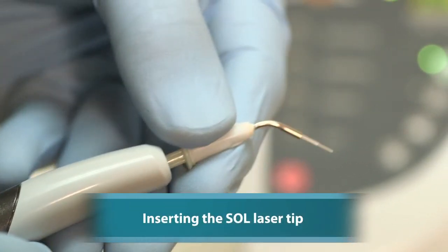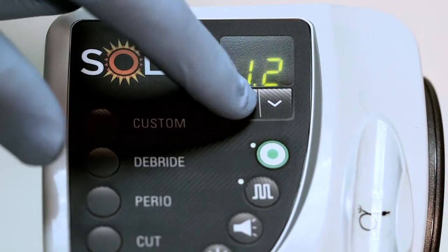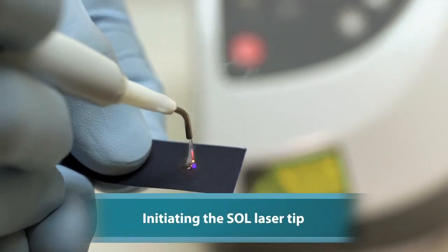Using a diode laser really takes the place of packing cord. I get good control of crevicular fluid, I have good hemostasis, and it takes just a few moments to open it up. I would also say it's probably imperative if you're doing any type of digital impression at all. The diode laser is sort of an indispensable part of getting a really good scan.